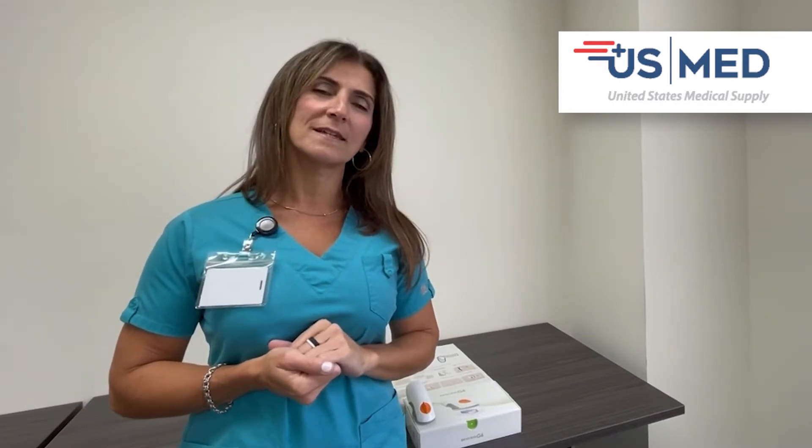Hi, my name is Shirley. I'm a certified diabetes care and education specialist for U.S. Med. I have been a clinician for 22 years and in the past nine years have been focusing on diabetes care.